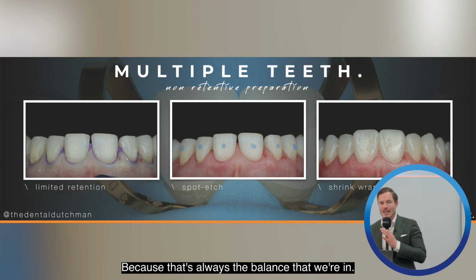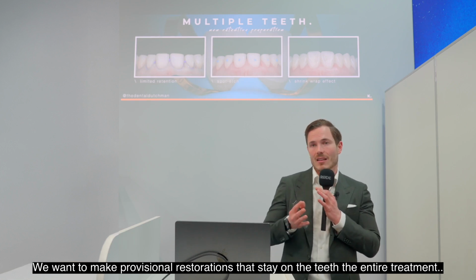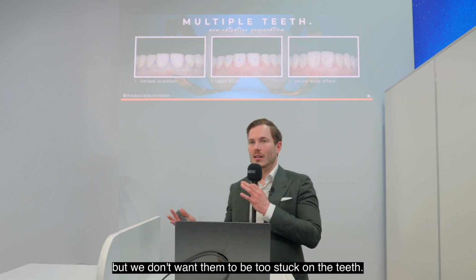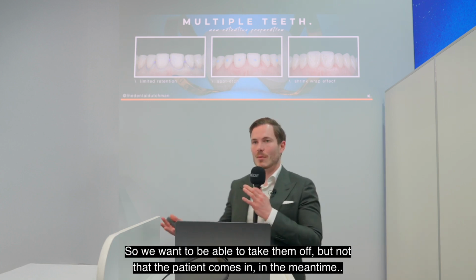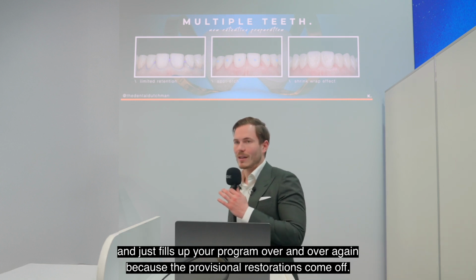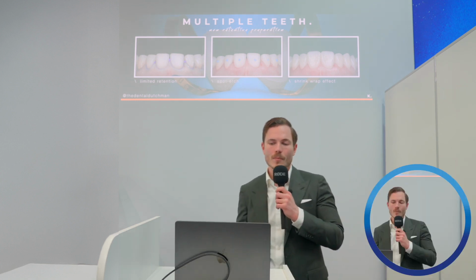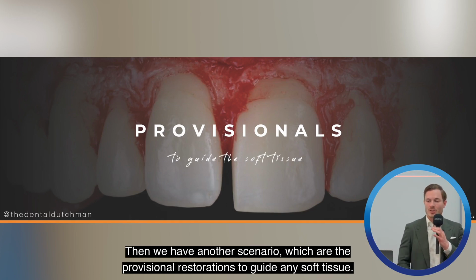Because that's always the balance that we're in. We want to make provisional restorations that stay on the teeth the entire treatment, but we don't want them to be too stuck on the teeth. So we want to be able to take them off, but not that the patient comes in the meantime and just fills up your program over and over again because the provisional restorations come off. That's always difficult. Then we have another scenario, which are the provisional restorations to guide the soft tissue.